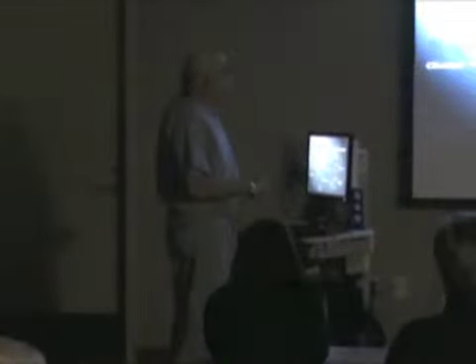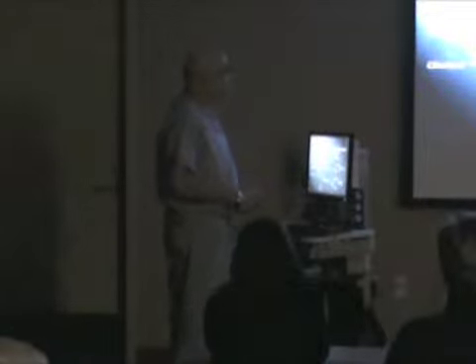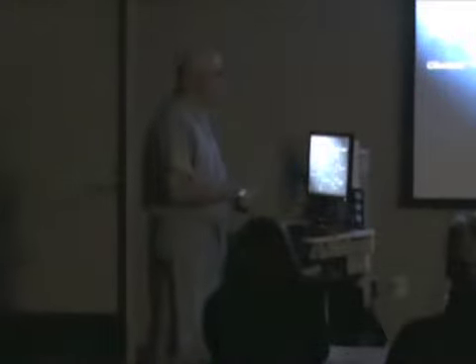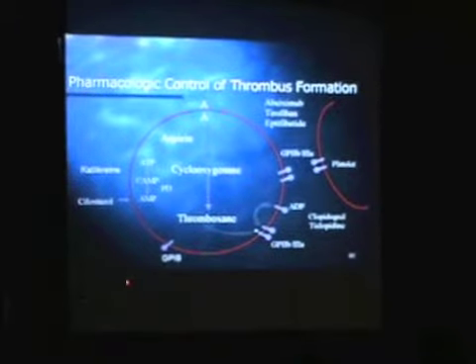Okay? So, what we're looking at with the aspirin assay is aspirin, as you know, is going to knock out cyclooxygenase, which will inhibit thromboxane. But what it also does is it sends an indirect signal to the glycoprotein 1b receptor on the platelet to turn off. This is your adhesion receptor of the platelet. Okay? So the way we counteract that in surgery is if we have a patient that's greater than 20% inhibited from aspirin going into a surgery, if they're bleeding at the end of the case, we recommend the drug DDAVP.